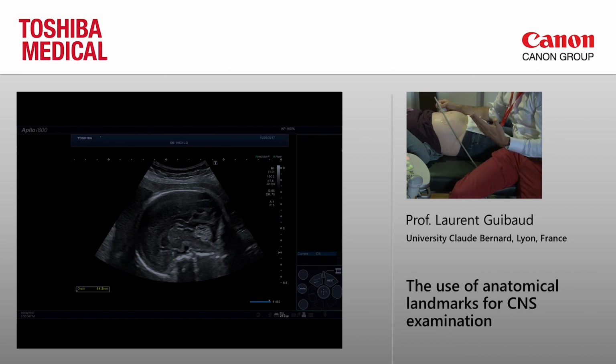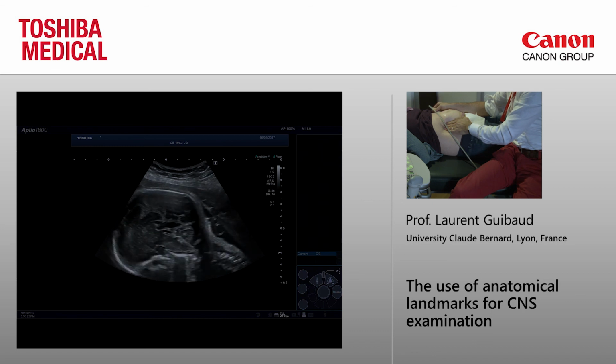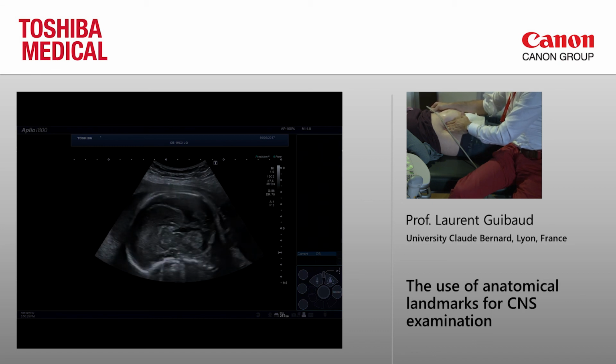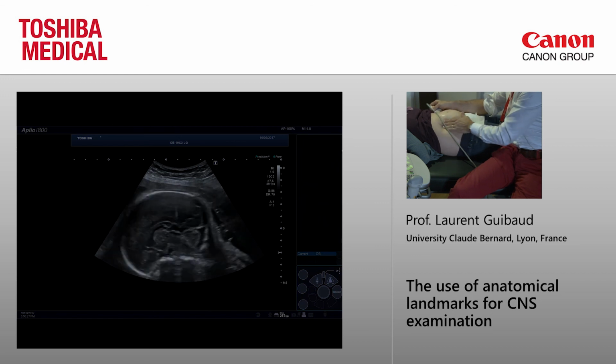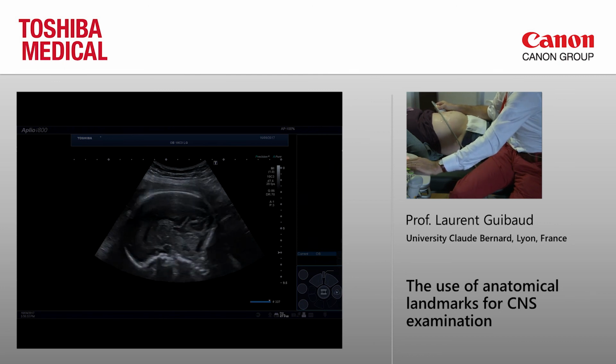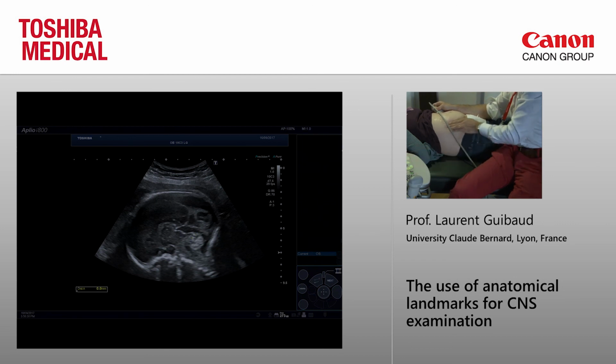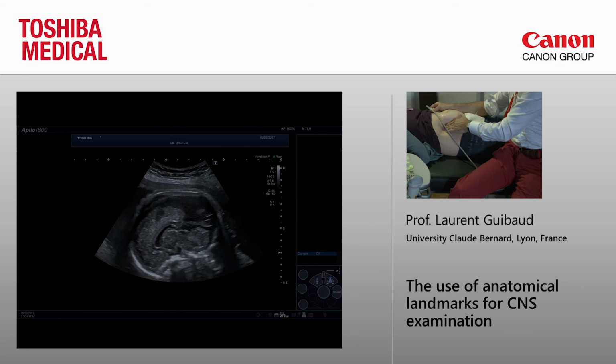The main concern is when there is a big cyst, sometimes there is in fact compression of the vermis. And in that case, sometimes the height could be just decreased because of the mass effect. So in that case, it can be interesting to try to have a good view of the vermis and try to see the primary fissure, which is a little bit tricky to see in that case. But here you see the primary fissure, which is here. You see this fissure? This is the primary fissure. I will show you maybe better.